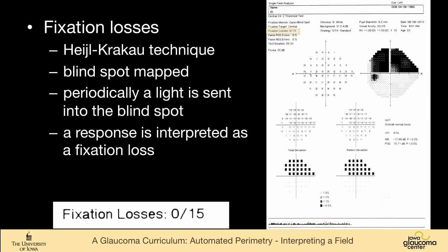So fixation losses are tested with what's called the Heijl-Krakow technique, where the perimeter maps the blind spot right here. And periodically, a light is sent into the blind spot. And if the patient responds to that, then there must be retina where the blind spot's supposed to be. And that's considered a fixation loss.